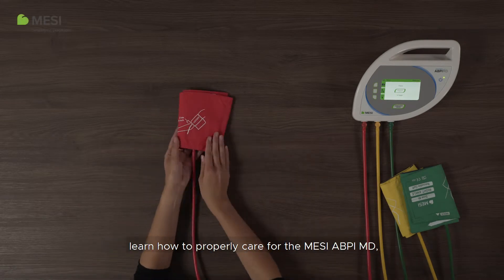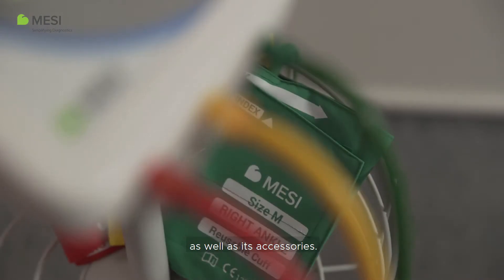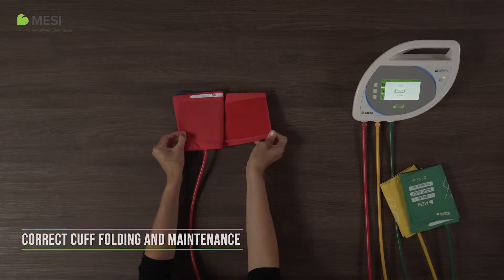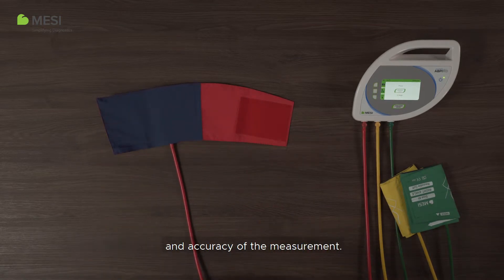In this video, learn how to properly care for the MESI ABPI MD as well as its accessories. Correct cuff folding and maintenance. Correct cuff folding is important to ensure the durability of the cuffs and accuracy of the measurement.